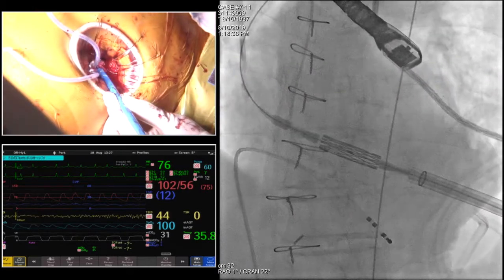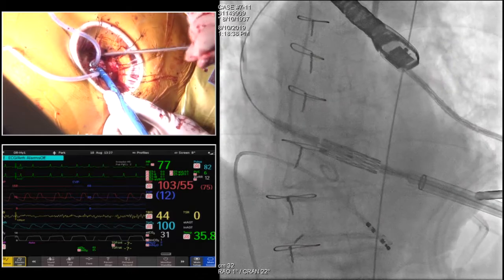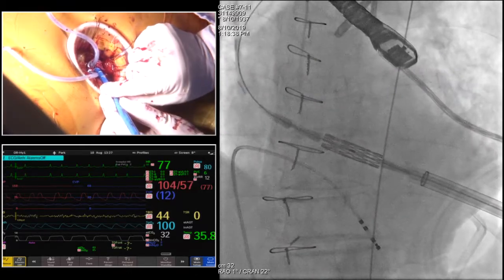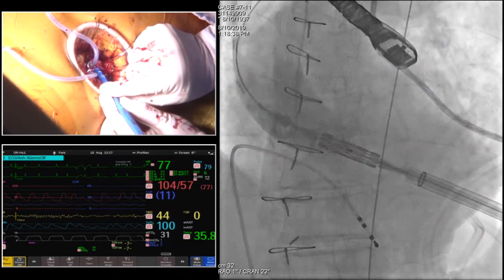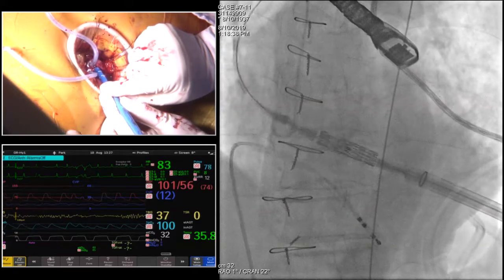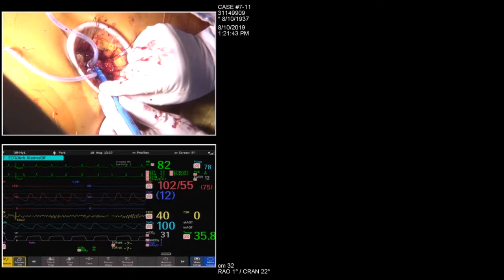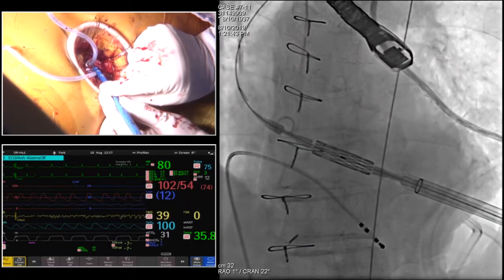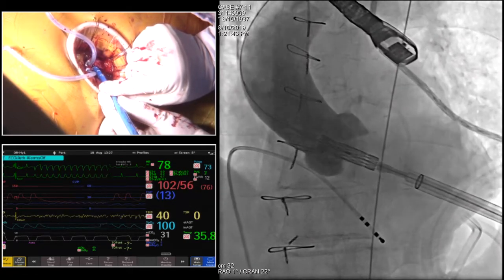I hope they're getting ready to deploy. I hope they loaded the valve alright. Okay, guys, good. Let's pull the pigtail back a little. Pull the pigtail back just a bit. Looks very good. Okay, test slightly. A little more. Okay, ready? If you think about it, it's pretty straightforward. Listen to me slowly. This part is straightforward. And you can control it perfectly, right? The surgeon can put it exactly where they want. Contrast. Okay, inflate. Perfect.